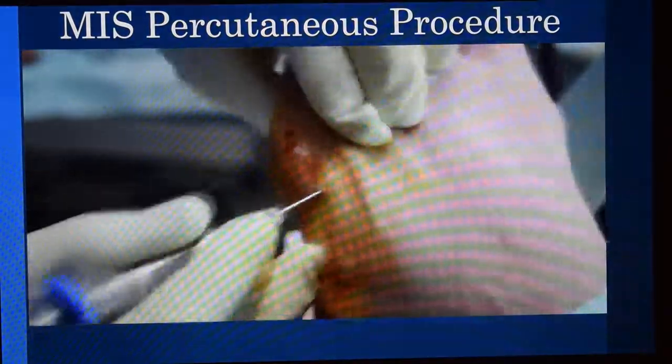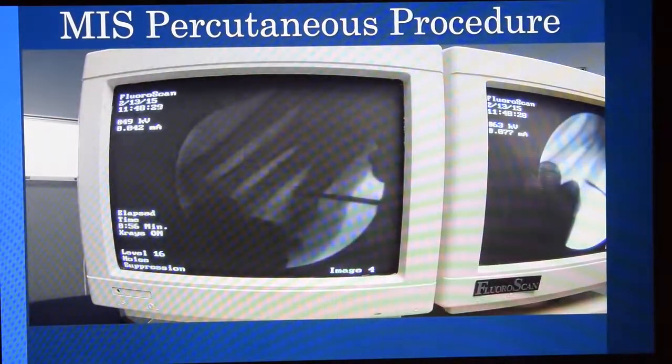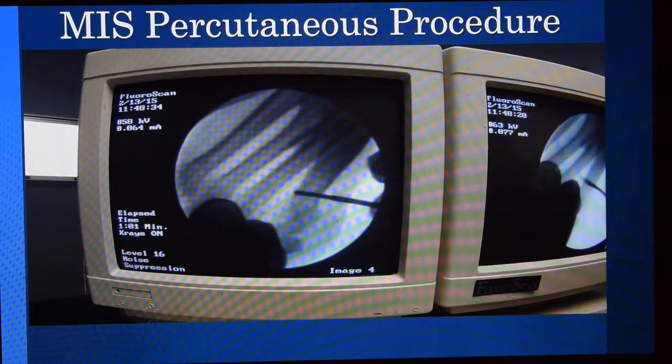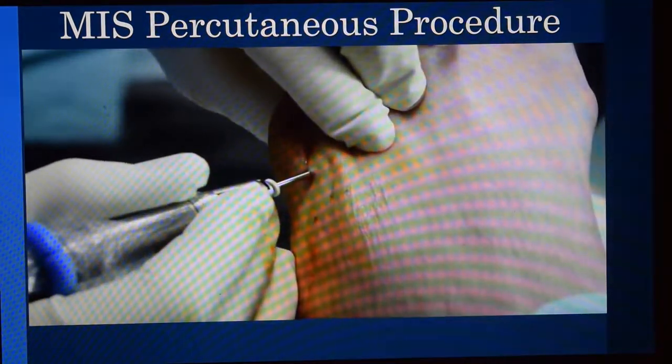A wedge osteotomy is then performed. This is also done under the guidance of C-arm, so you know exactly where you are. So you know you're not too far in the intermetatarsal space, but know exactly where your position is at. We'll cut this slightly in a little bit of position where you maintain some length to the metatarsal.